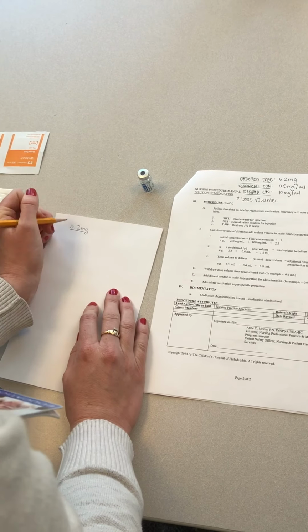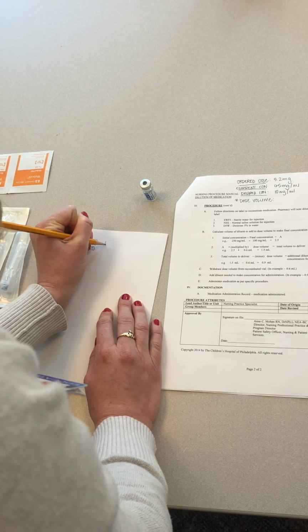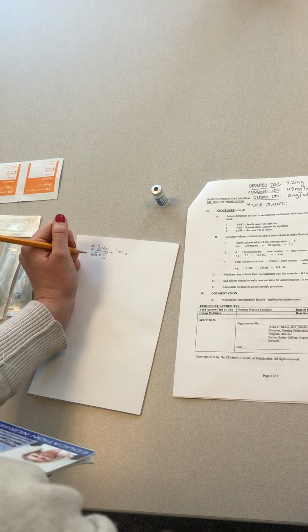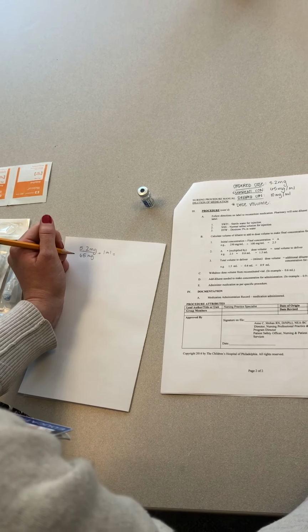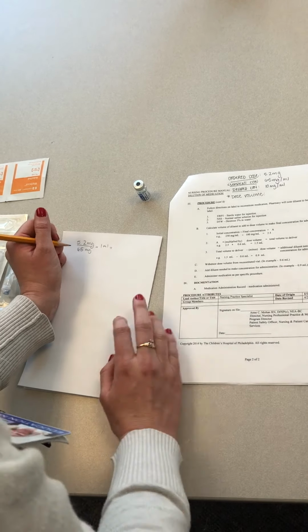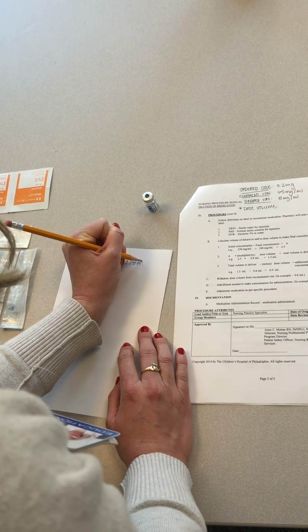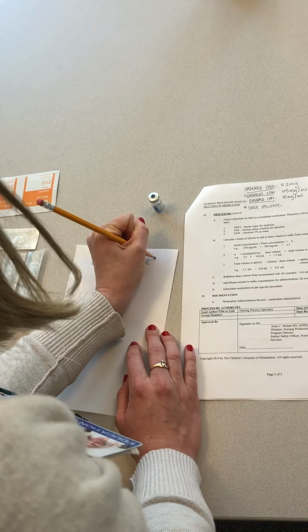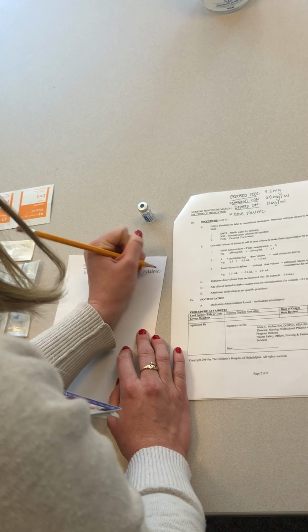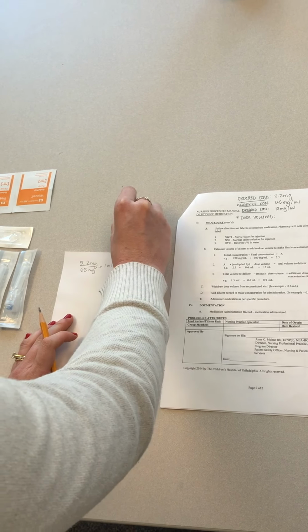And so we will divide to get our dose volume. 5.2 divided by 65 gets me 0.08 milliliters. So that is my dose volume. That's the amount that I'm going to draw up from this Phenobarb vial when I'm ready to do so.